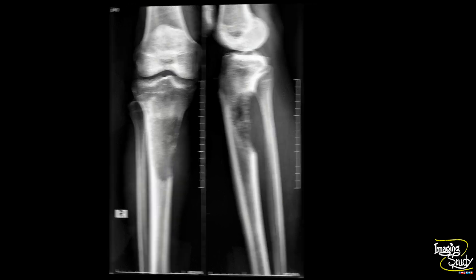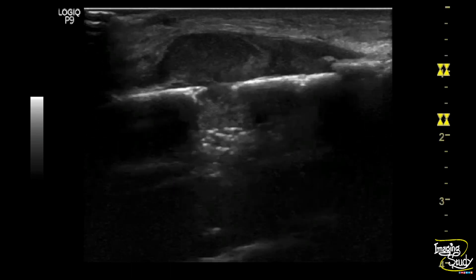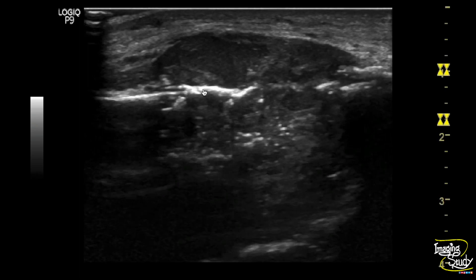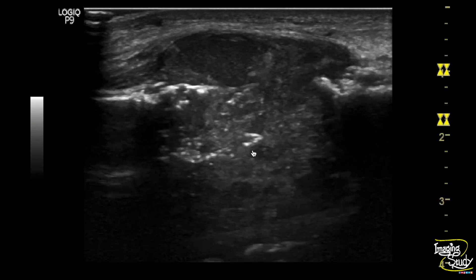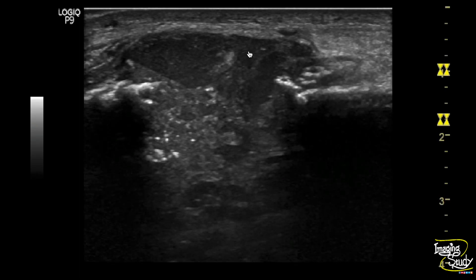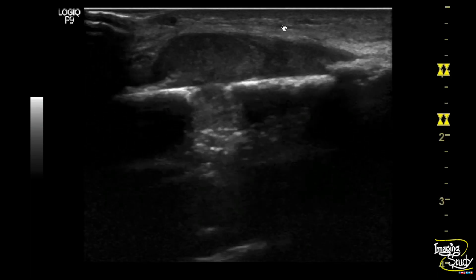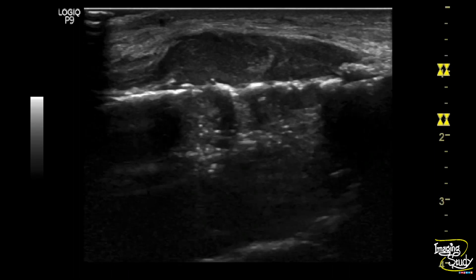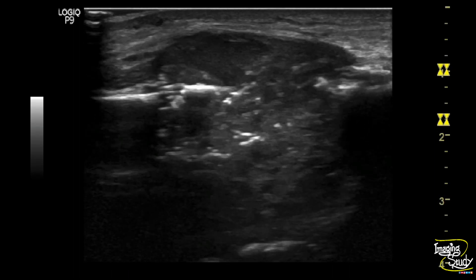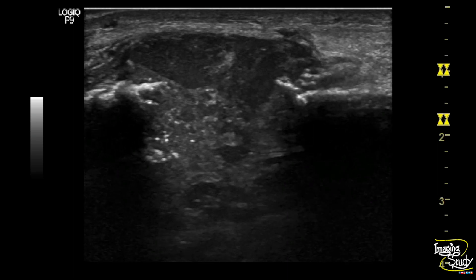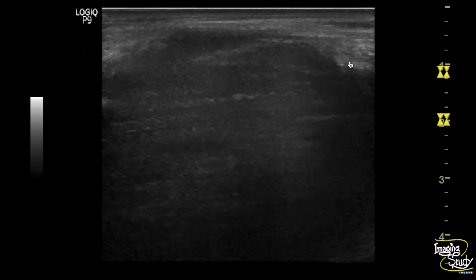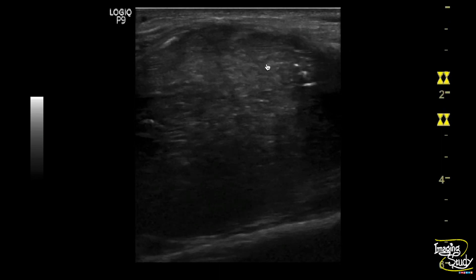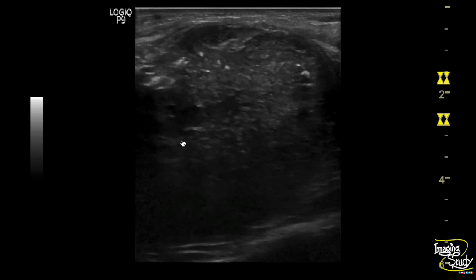Here you can see the longitudinal section of the swelling at the supermedial aspect of the tibia. This is the tibial bone — you can see fragmentation and lysis of the bone at this part, with a heterogeneous soft tissue that compresses the overlying muscle and subcutaneous layer. You can see some echogenic bony fragments within this soft tissue. This is a fairly large collection with some calcific foci, possibly due to adjacent tibial osteolysis.